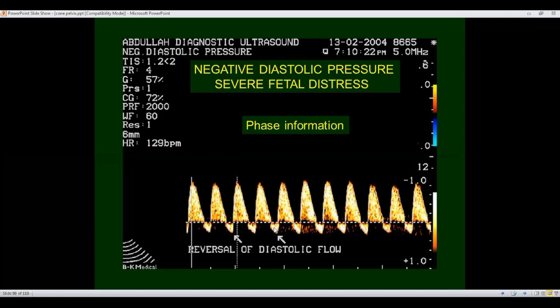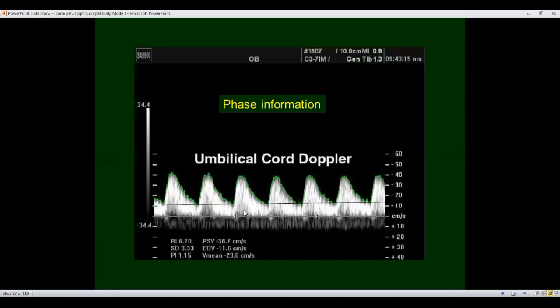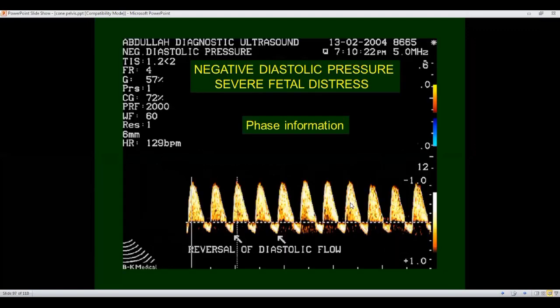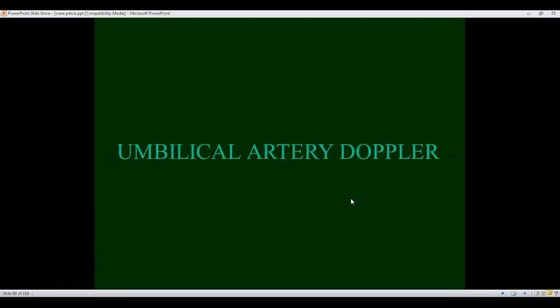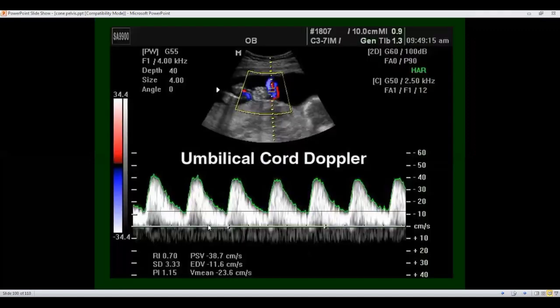In other words there is a positive push but then it recoils back. This type of negative diastolic flow is seen when there is fetal distress, and this type of positive forward diastolic flow is seen in normal fetuses. Now I'm going to show you how the umbilical artery Doppler normally is - as you have just noticed there is a systolic rise and diastolic fall and there is a forward diastolic flow all the time.